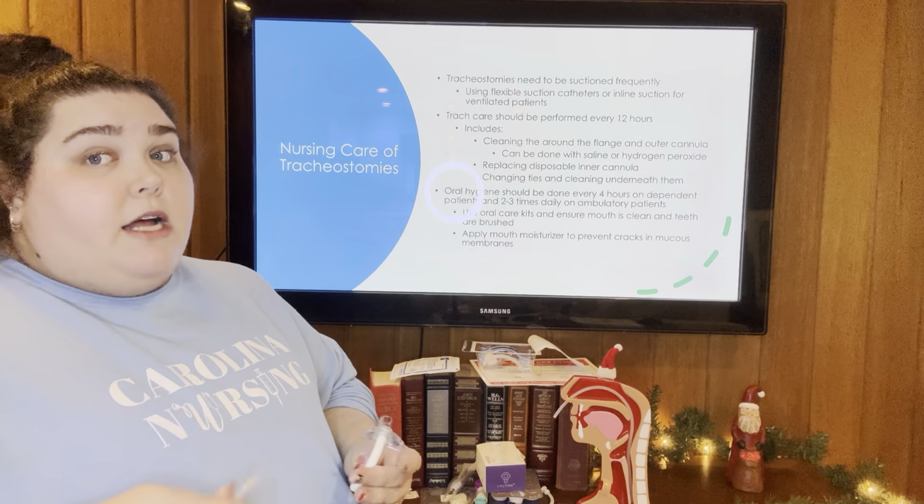So then here is one of our friends, Manny Quinn, and he is going to teach us about trach care of the hospitalized patient. Quick overview of trach care. First, let's do hand hygiene and don sterile gloves. Next, we're going to set up our sterile field. Be mindful of the 1-inch border. Then we're going to remove the inner cannula and clean the inside and outside with saline and a brush.